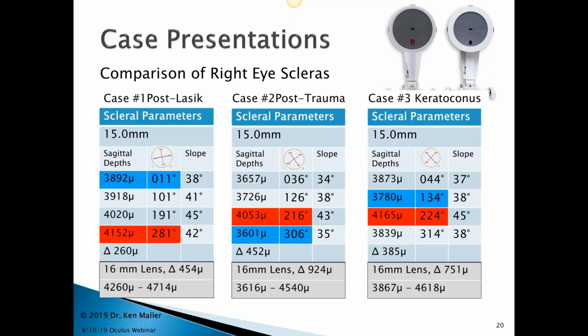First, in terms of data acquisition, they're all very similar in terms of how much time they take. And again, the problem is the lids of the patient. If the patient didn't have lids, this would all be very easy, but of course they do have lids, so we have to work around that, and getting the lids out of the picture is critical to being able to get good scleral data. The Pentacam is different from the ESP and the SMAP 3D in that it is not taking reflected data off the surface of the sclera, it's doing it through a camera, whereas both the ESP and the SMAP 3D require reflections off the surface.